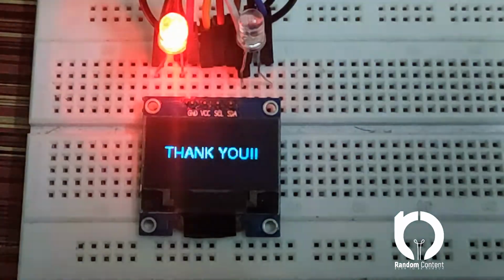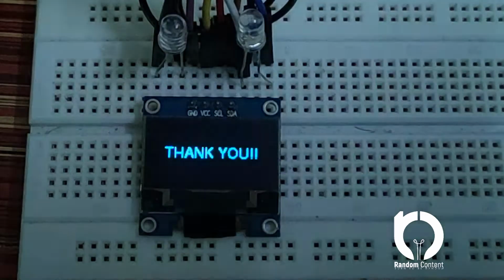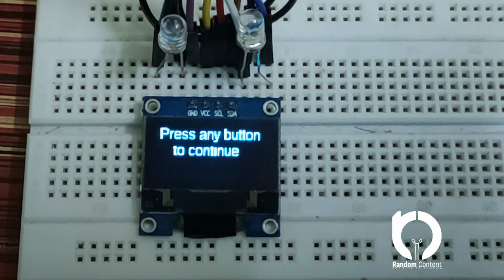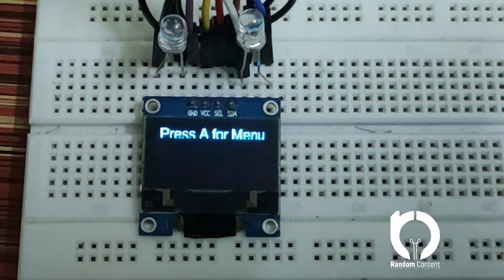It will show thank you, and the light will blink. After about 10 seconds, because this was a standalone project, I did not take it as far as closing the program, so I let it stay in the loop. After about 10 seconds, it will again ask to press any button to continue. So it will stay in the loop.